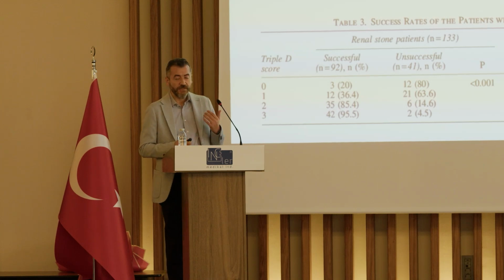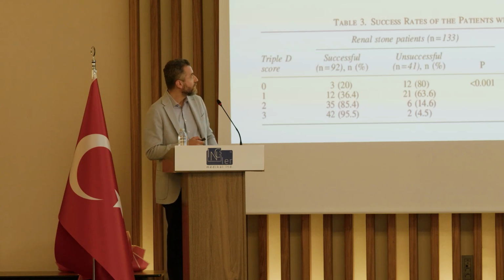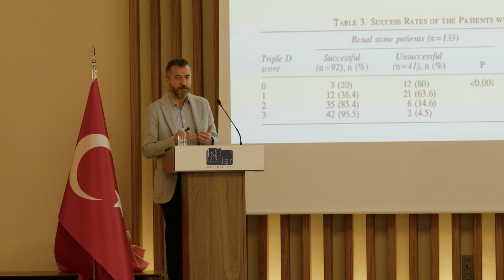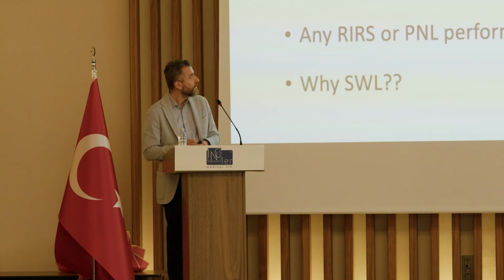And this is actually one of the studies in which we evaluated some factors that can have an effect on the outcomes of shockwave lithotripsy. In the end, we found that the stone diameter, skin-to-stone distance, and the density of the stones are really important, and we actually have some cutoff values for these parameters. And if we have a favorable patient, then the stone-free rate of shockwave lithotripsy can be as high as 95% when we apply it correctly.